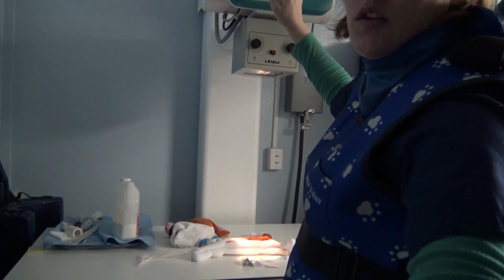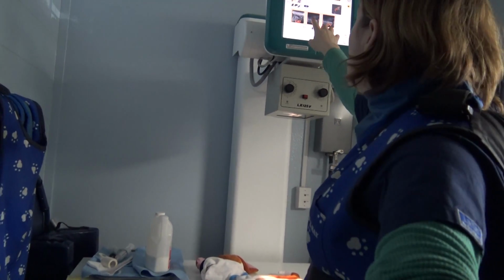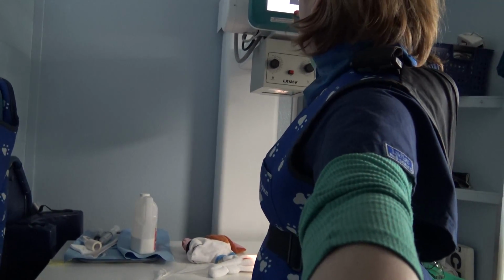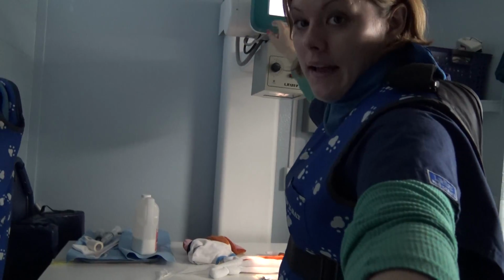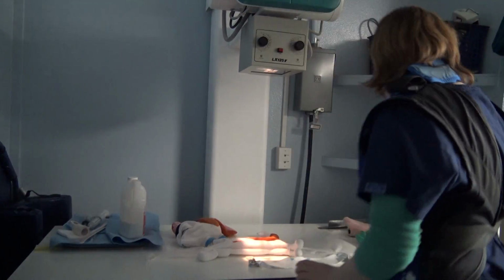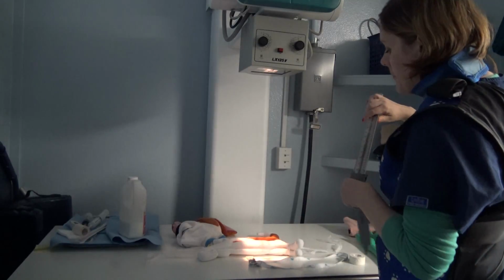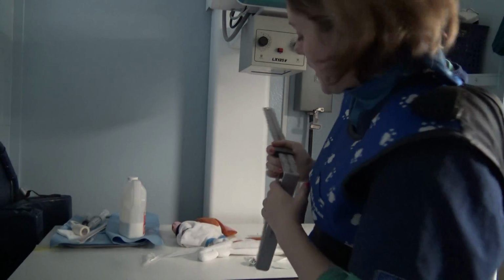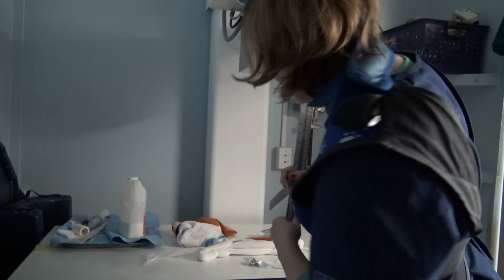Up here, it's hard to see, I have entered that we are a dog, that we're doing the abdomen and lateral. Now that I'm in the position that I'm going to be in for the x-ray, you want to go ahead and use your caliper and measure. You're going to measure about the 13th rib, or the thickest part of the x-ray.